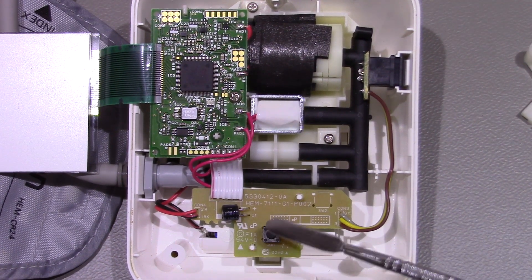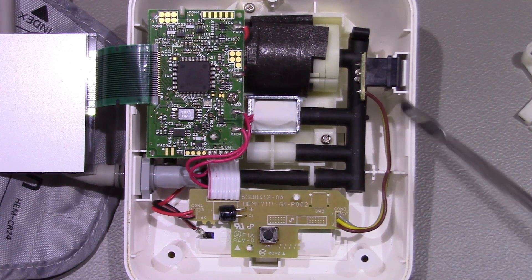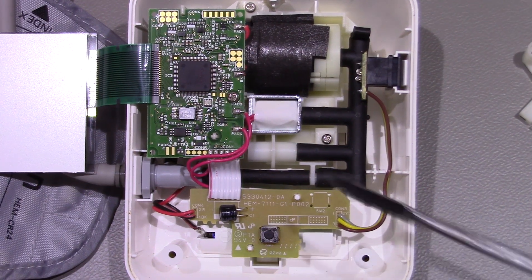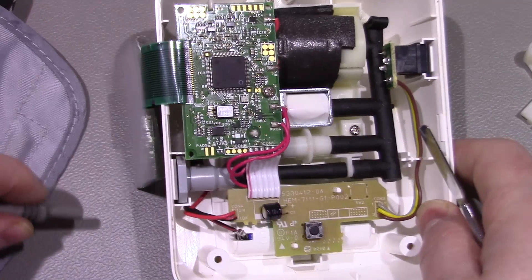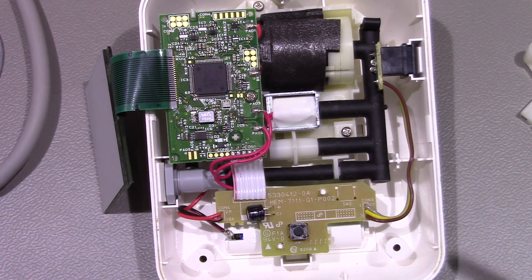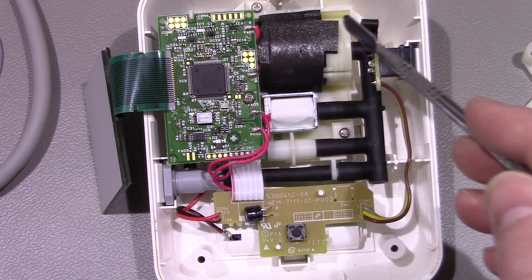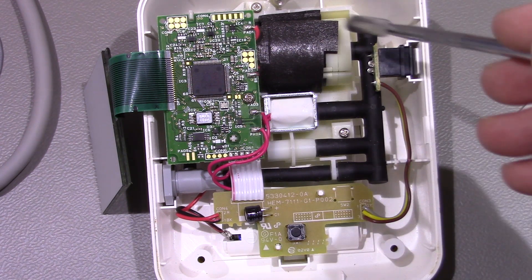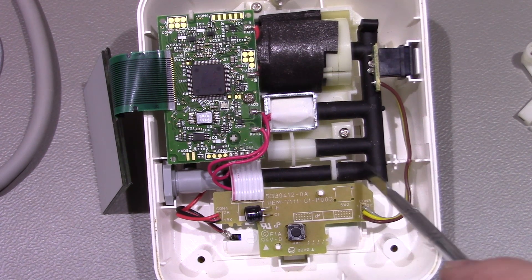So here we can see inside. We've got a switch here - that's what you press to start the device. We've got our DC barrel jack with the cable coming over there. This is your outlet to your pressure cuff. On the main board here we've got a motor and a little attachment which obviously creates the pump to inflate the cuff, and some sort of pipework along here.